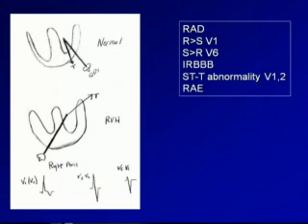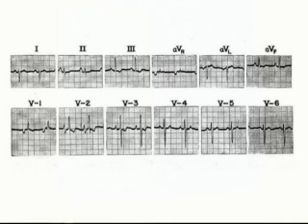Here shown graphically, if we're going to try to rotate our QRS, we're going to rotate it out towards the right ventricle. What's going to happen then is my R wave is going to grow in height in V1 and V2. My S wave grows in V5 and V6. So my criteria for RVH, and there's no numerical values for this, is right axis deviation, R greater than S in V1, S deeper than R in V6, the incomplete right bundle pattern with a slight delay and our slight increase in QRS duration, the backward shaped check mark in V1, V2, and concurrent right atrial enlargement.